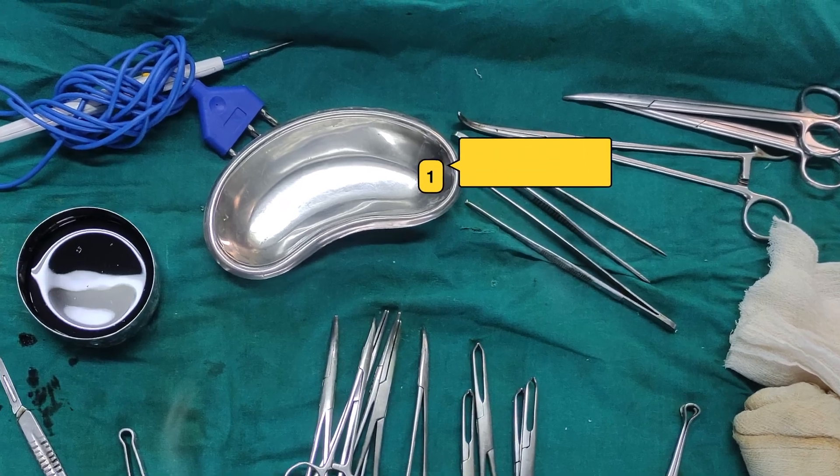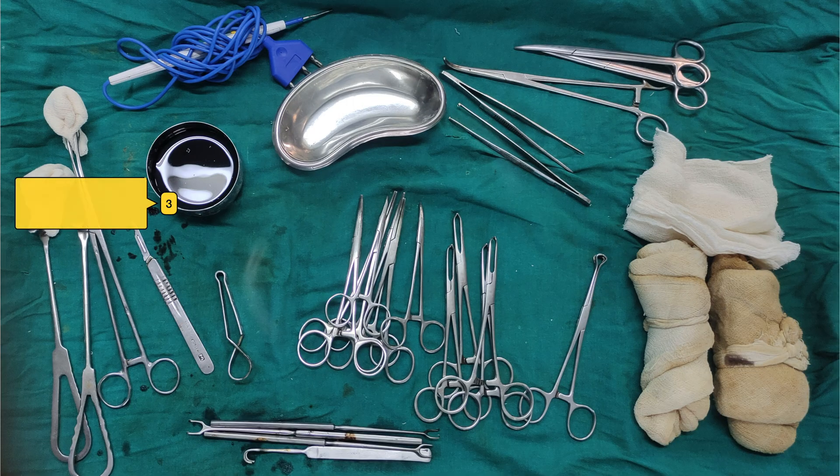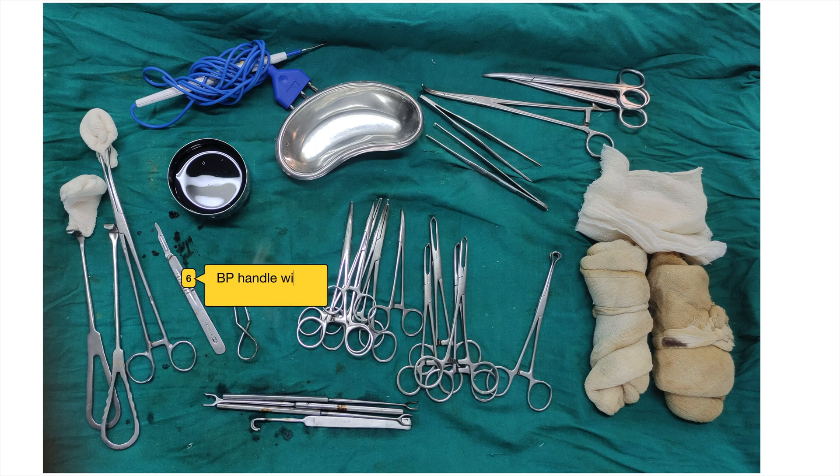1. Kidney tray. 2. Electric cautery. 3. Povidone iodine bowl. 4. Sponge holding forceps with gauge piece. 5. Langenbeck retractor. 6. BP handle with scalpel blade.